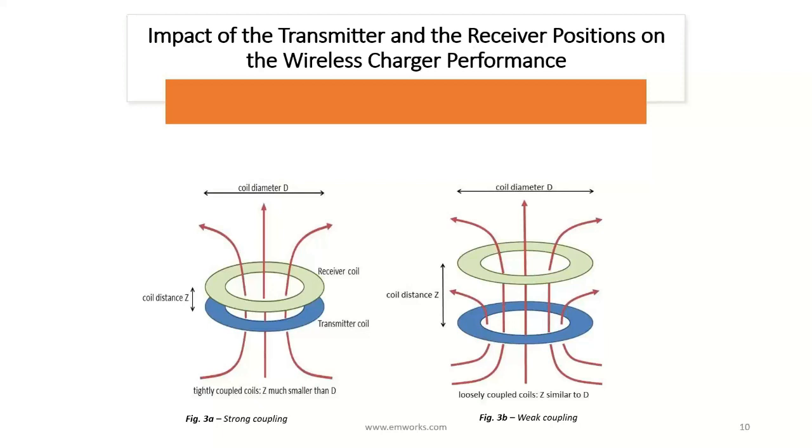When the diameters of wireless charger coils are big enough compared to the air gap between both of them, the coupling is considered tight and the efficiency of the system can reach maximum values. While in the opposite case, a big amount of the magnetic field transmitted by the primary coil won't reach the receiver coil. Hence, the induced back EMF will be small.